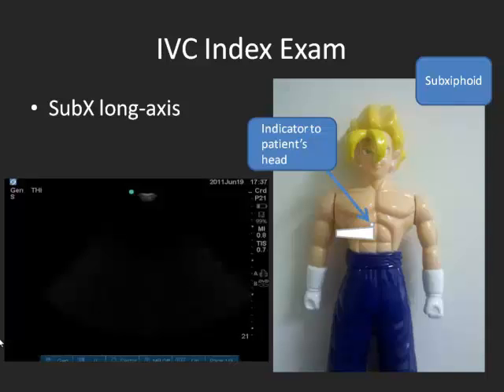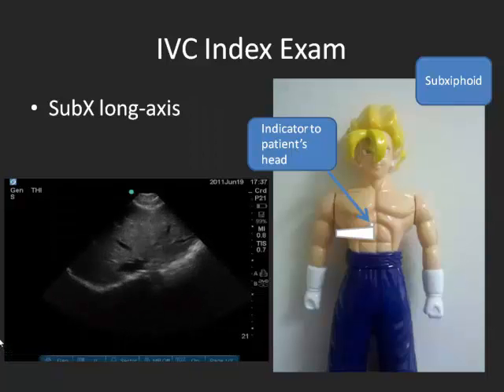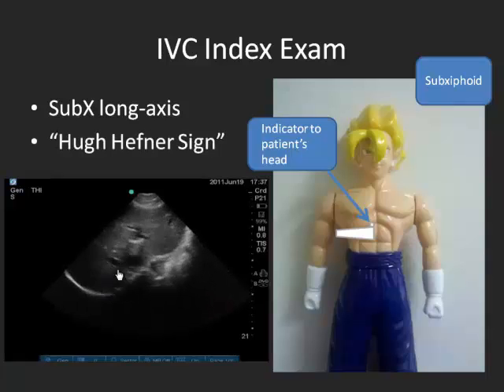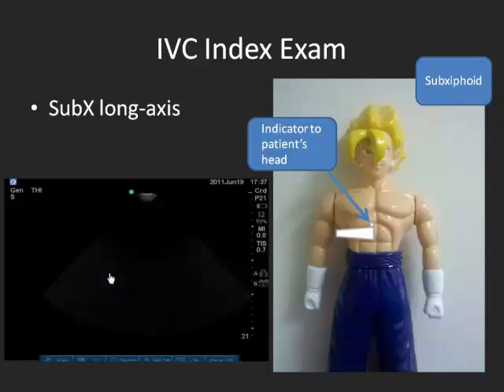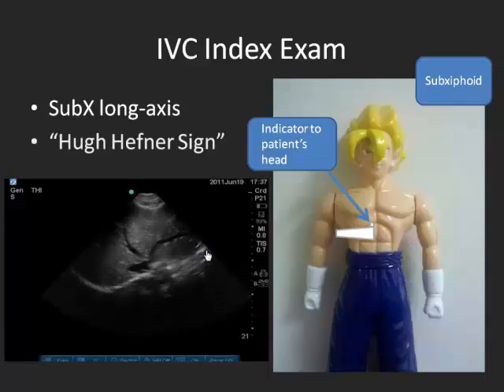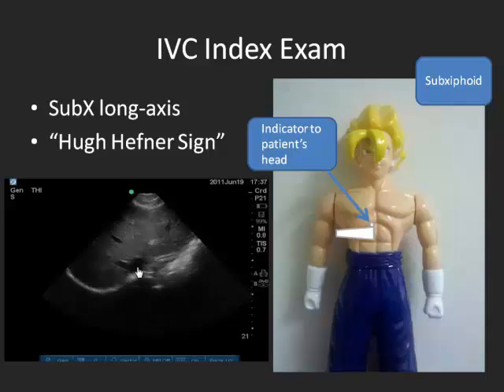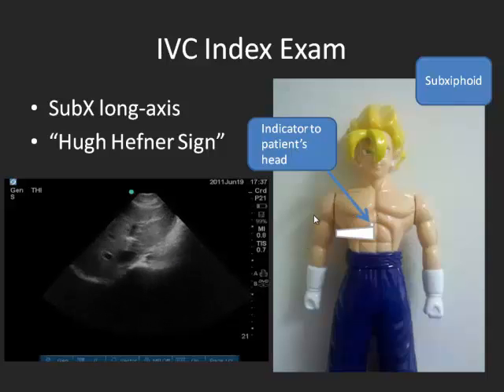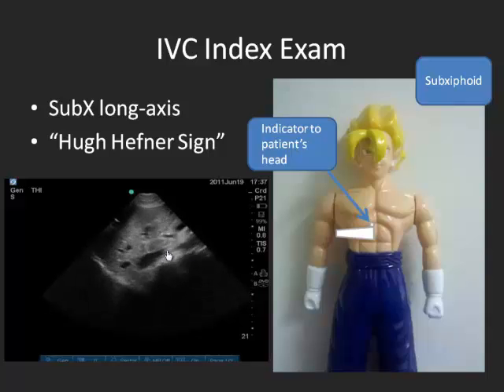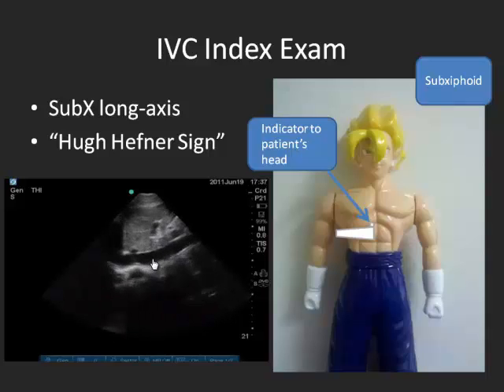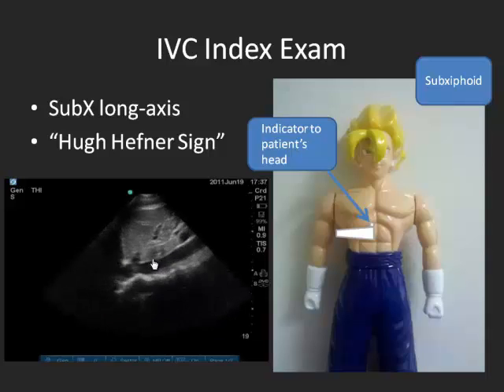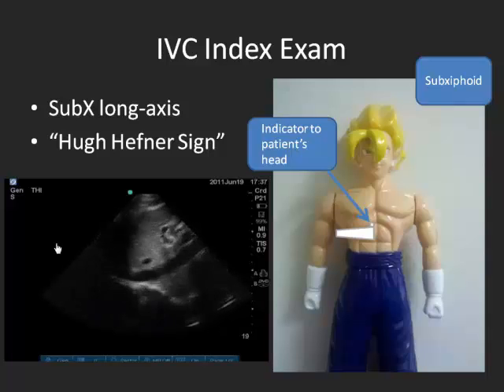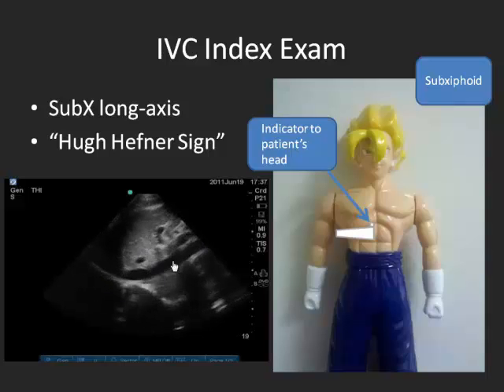I like to go sub-xiphoid as if I'm looking at the heart. When you look more toward the liver — what I call the Hugh Hefner side — you will see the bunny ears, and that is the IVC. Once you see the IVC, rotate the probe toward the patient's head and you'll get a nice long black line, which is your IVC. You can always confirm it by following the IVC to the right atrium.